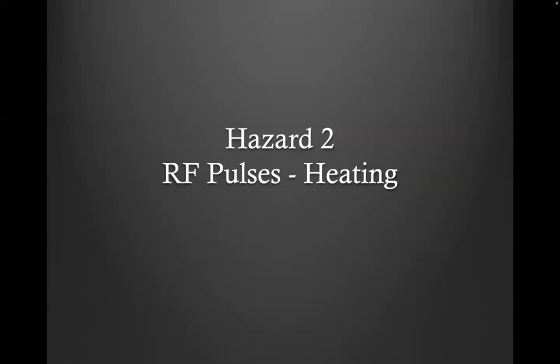Okay, that's a lot about the main magnetic field. Now let's move on to the second hazard, which is RF pulses. It's radio frequency pulses, which mainly could cause heating.